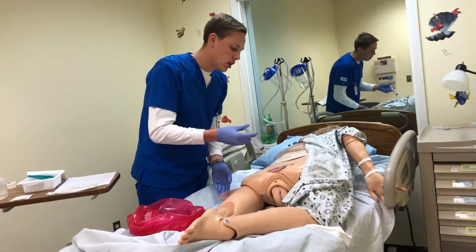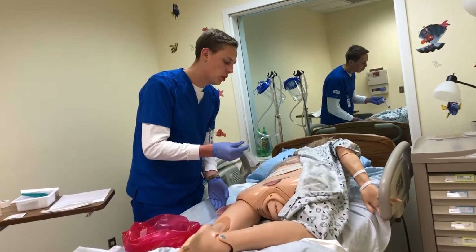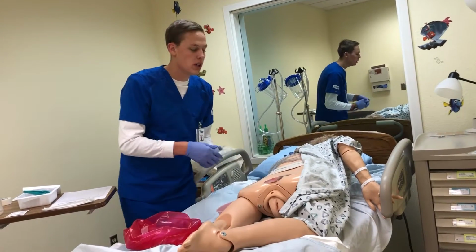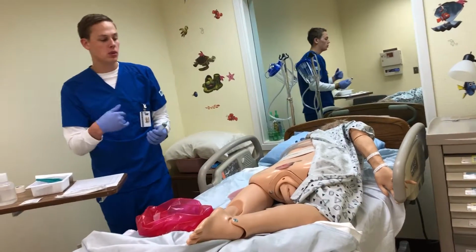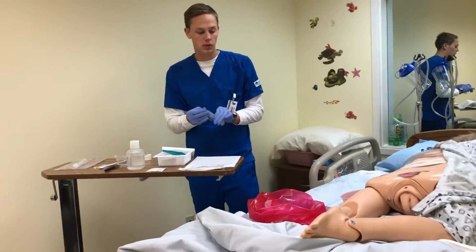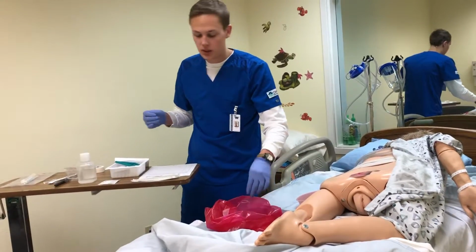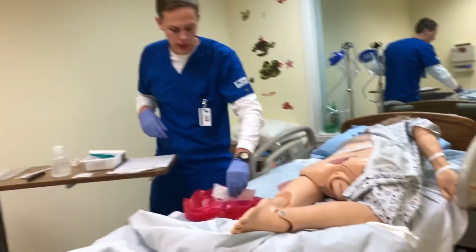I'll do this as many times as needed until I get a clear return. So it might just be one syringe, it might be 3, but I just want to keep doing it until I have a clear return. There's minimal blood, there's minimal pus. And then once I'm finished with that, I can dispose of this into the biohazard and this into the sharps. That can go in there as well.